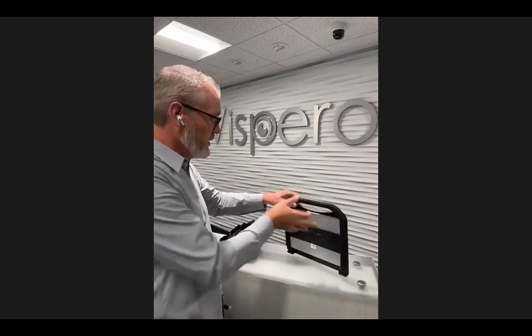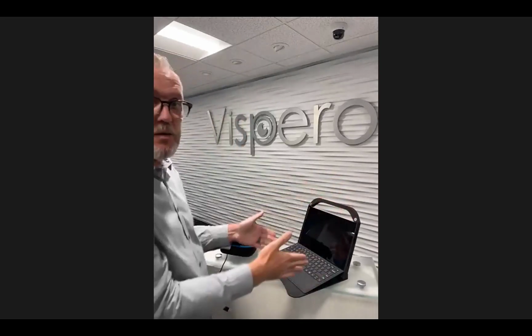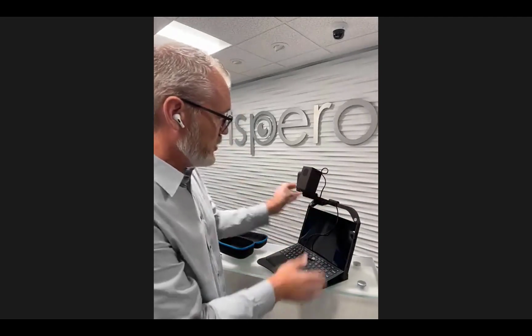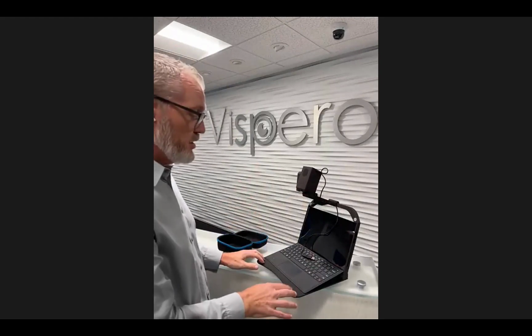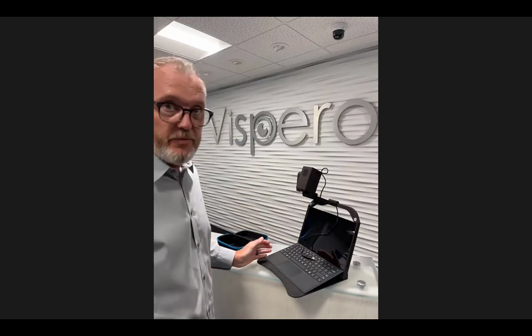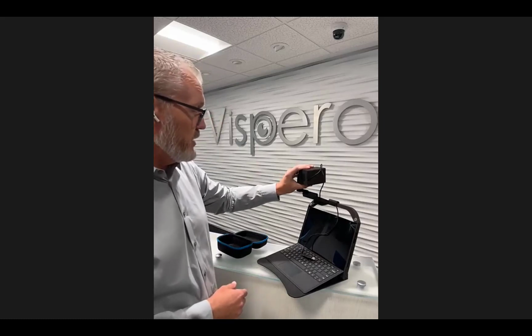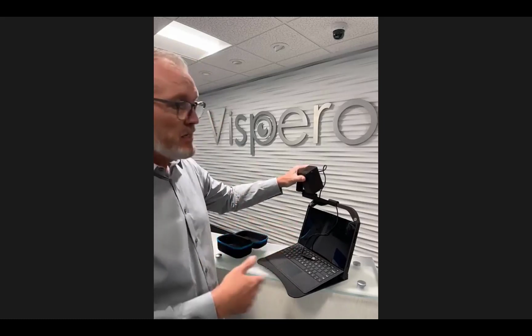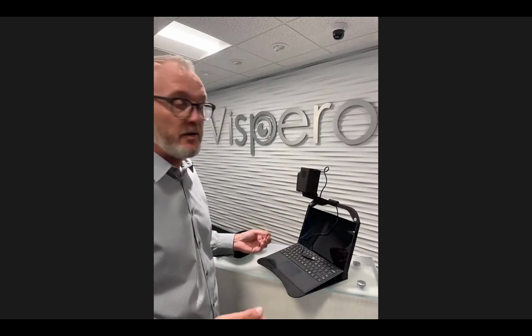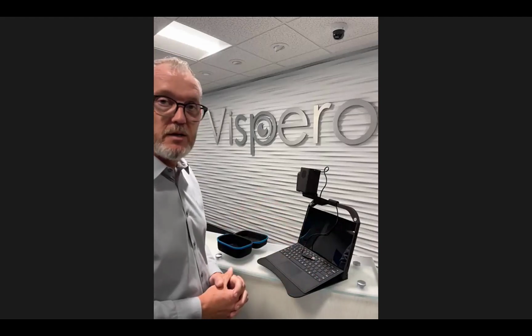In order to try and get it into this inline type form factor in a laptop environment, you can see that by having the camera reach out this far, a sturdy platform is obviously, like any magnifier, going to be preferred. We do have image stabilization, but depending on how far out you are, if you're on an unstable surface, again, just like any other magnifier, it's going to resonate through the image. So always try and make sure you get a nice firm platform.